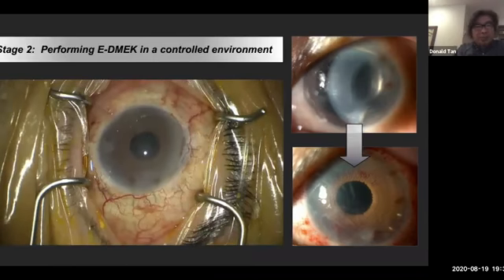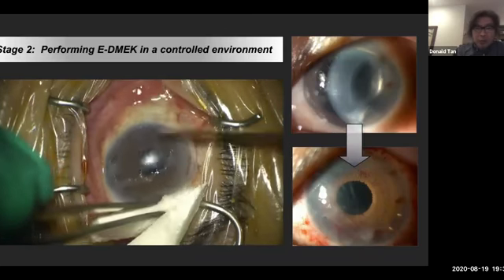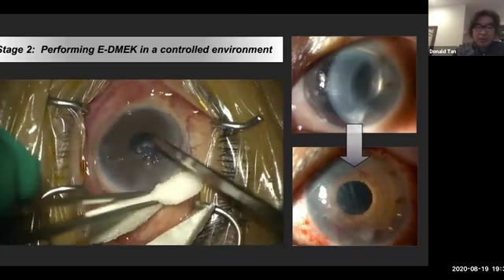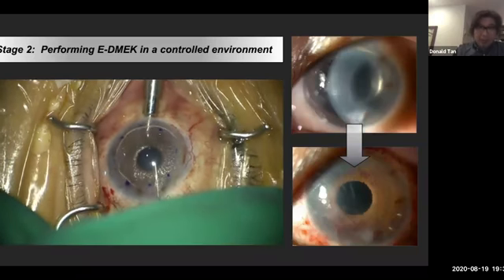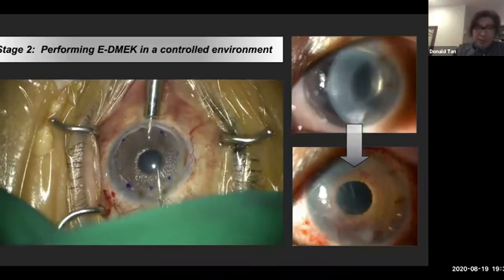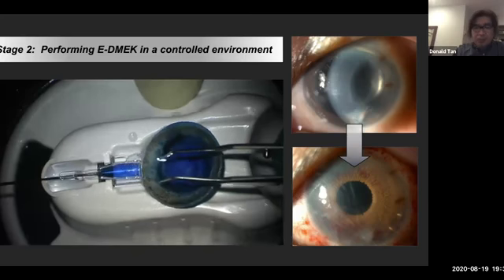And this is about a month later. You can see the eye's quiet. The iris looks pretty normal. The chamber is normal. And really the whole concept is that now this is almost like a normal DMEK. Okay, good thing is air stays here, so the chamber doesn't collapse. You can get it a little bit shallow, but it won't collapse on you.